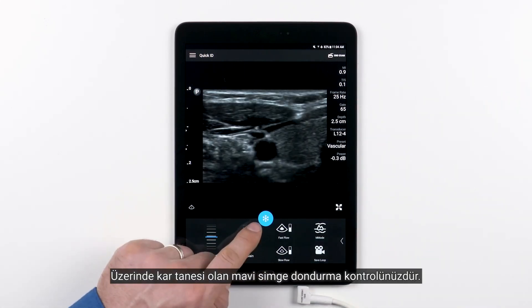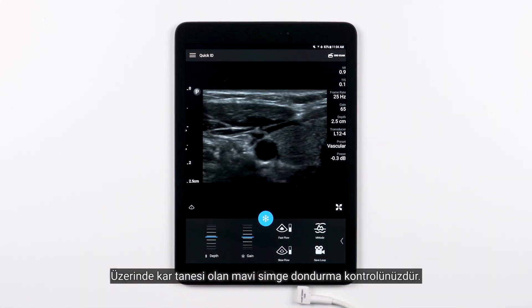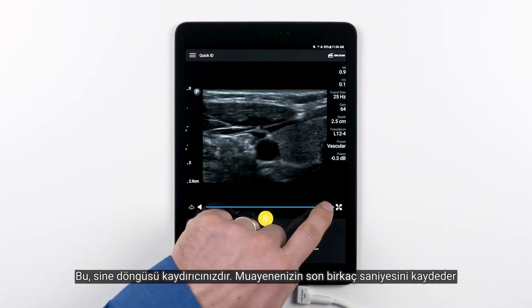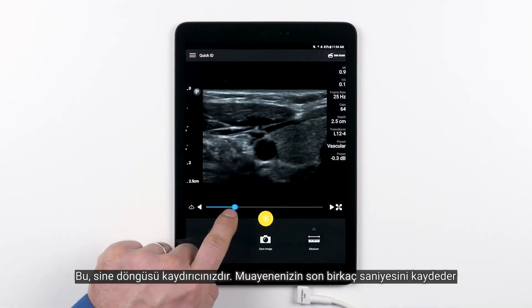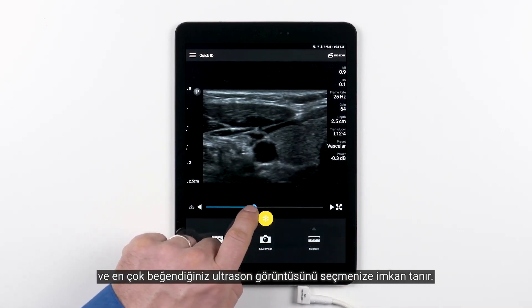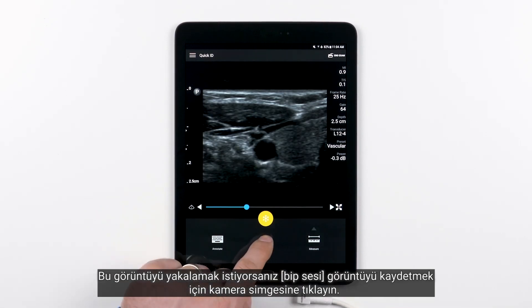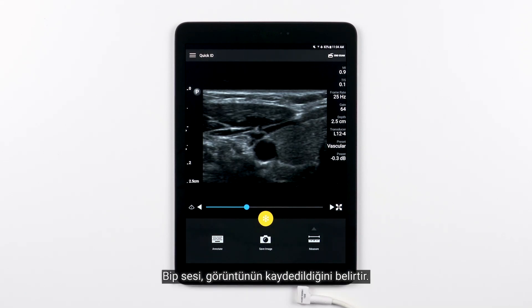The blue icon with the snowflake on it is your freeze control. When you freeze the image, you have other controls available to you. This is your CINE loop slider. It records the last few seconds of your exam and allows you to pick the ultrasound image you like best. If you want to capture that image, tap the camera icon to save the image. The beep lets you know that it has been saved.